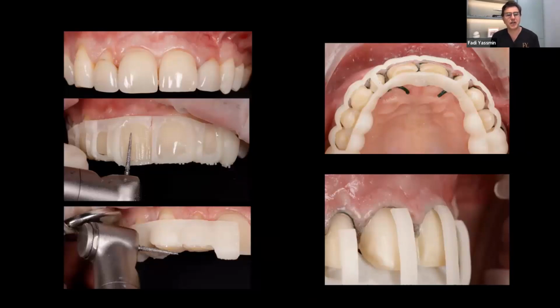Hence, we use our preparation guides. We already have our design, and you're familiar with these control guides. Again, it's a close-up of the labial. You can see the interproximal to be able to achieve these. And again, it's a protocol following the design, using tools, being able to conveniently print, being able to easily print all these tools to help you to achieve the desired outcome, which you're able to very confidently show the patient using digital dentistry.